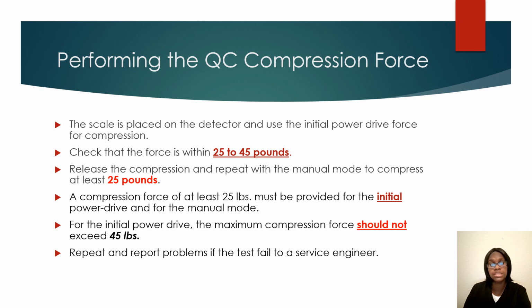Performing the QC compression force. The scale is placed on the detector and you use the initial power drive force for compression. Check that the force is within 25 to 45 pounds. Release the compression and repeat in the manual mode to compress at least 25 pounds.